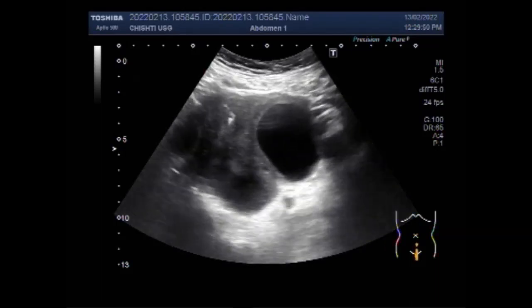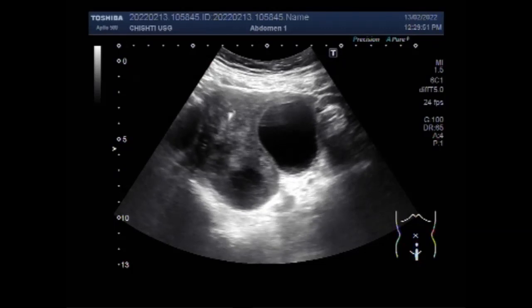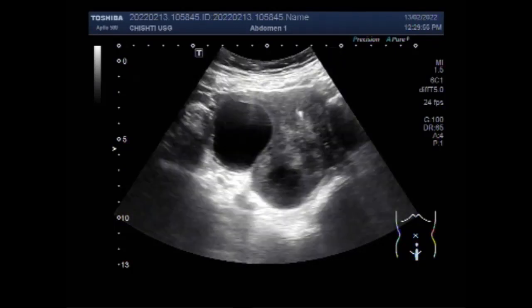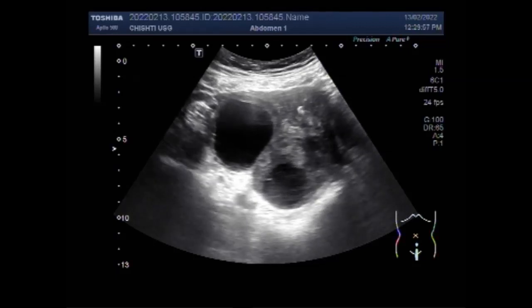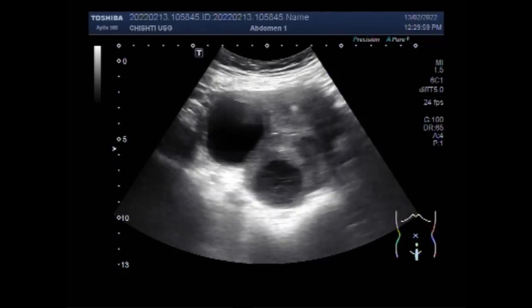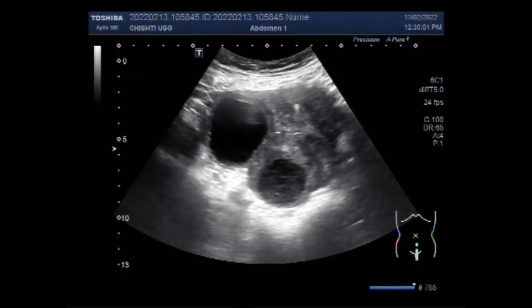You can now see both the cysts. The right ovary shows a simple ovarian cyst while the left ovary shows a hemorrhagic ovarian cyst. This is the right ovarian cyst.